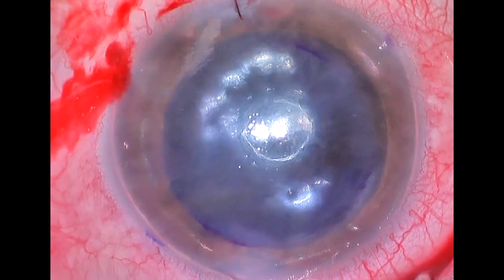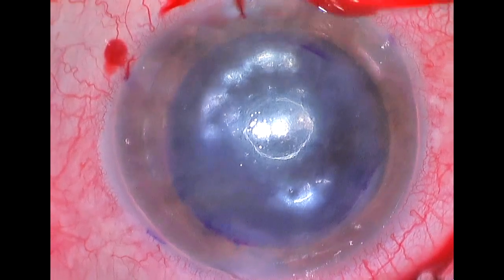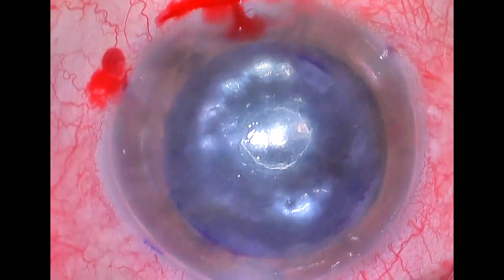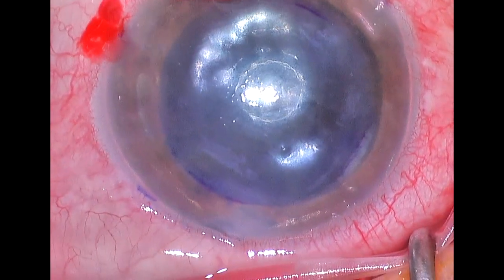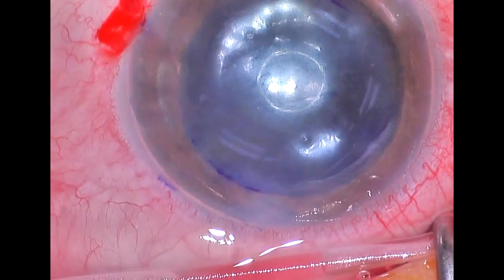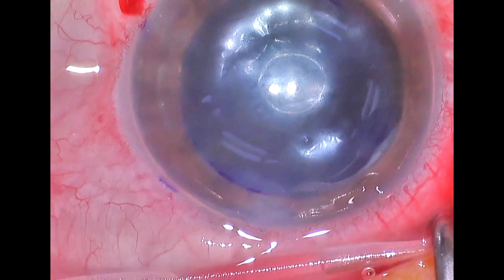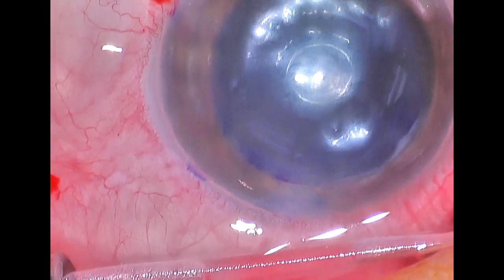Oftentimes we will ask the patient if they can see light through that eye. They're not able to see clearly, but they can tell if there's light or no light. Sometimes, because of the amount of anesthesia they've gotten, they're not really able to tell accurately whether that eye can see light. Now we give our subconjunctival medications — and that's it. Our graft is in perfect position and the proper orientation. We will see this patient in an hour, let some air out, and then they'll go home and be told to lay flat on their back as much as they can tonight.